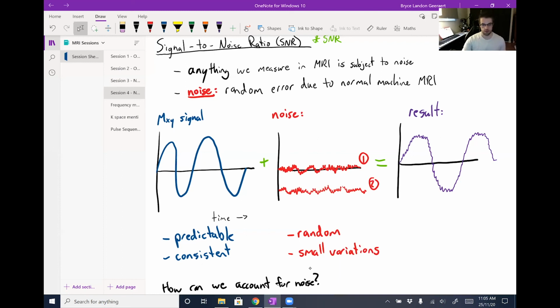Okay, so Chelsea has a question asking if higher resolution images would have more noise and be lower quality. Yeah, that's definitely true. Generally, in an image with more voxels, noise has a higher chance of impacting the image, because each voxel or pixel itself has less signal binned into it. If we think of imaging a part of the body, there's a consistent amount of signal available, and if we divide that into smaller and smaller bins, then noise will outweigh the available signal in each bin.